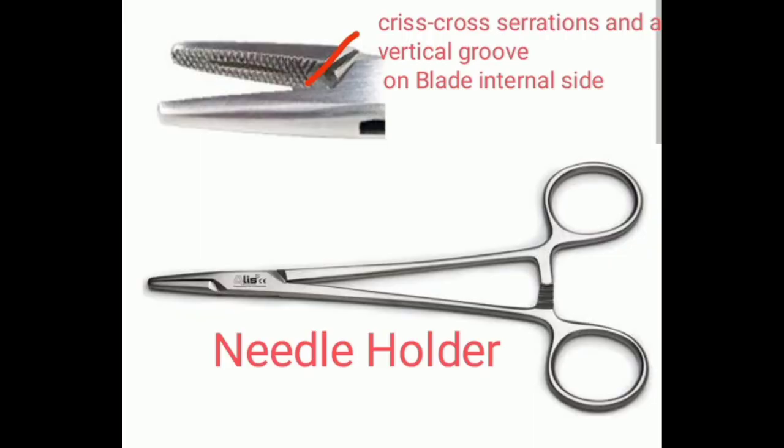This is a needle holder. The specialty of this instrument is that it has very short blades. Internally the blades have crisscross serrations and a vertical groove in the middle. The blades have crisscross serrations and a vertical groove in the middle with short blades, and the body part is long. It is called a needle holder forcep and is used to hold the needle for the purpose of suturing.